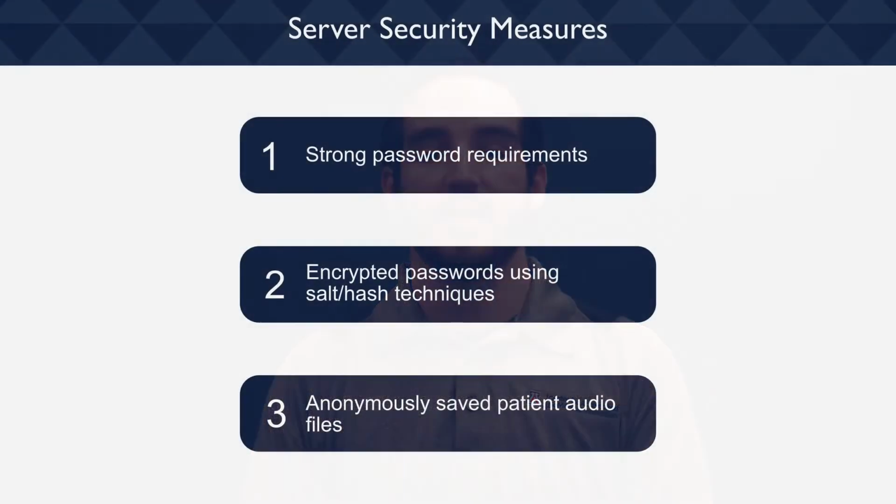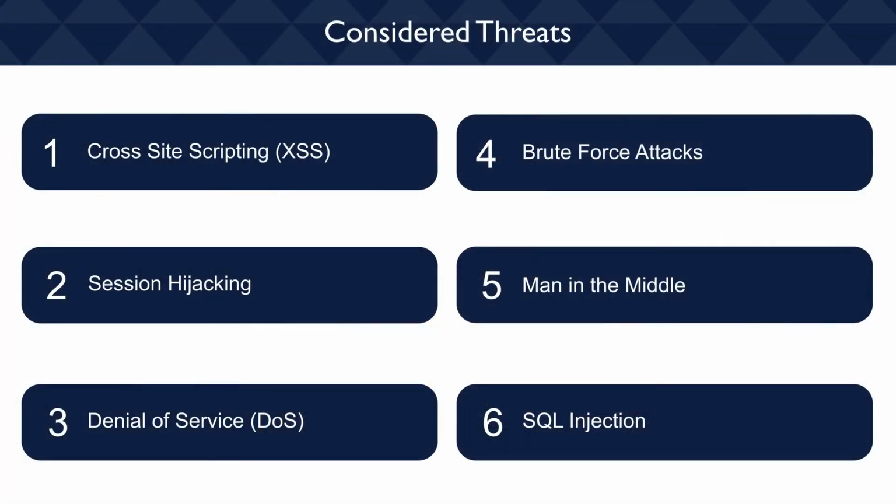A product is nothing if it doesn't work properly. With this in mind, we set out to ensure that our product is secure and functions properly under various predictable and unpredictable conditions. To ensure security, we implemented cybersecurity practices to defend against common threats. This includes protecting user and patient data with strict user login credentials, encrypted password storage, and encrypted patient audio file storage. This also includes protection against attacks like cross-site scripting, session hijacking, and denial of service.